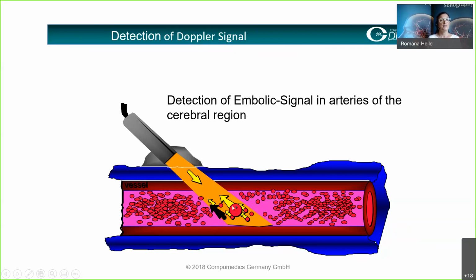And then here we have the example of a blood thrombus, and since this is also heterogeneous tissue, it might give us a little more energy or intensity back than the single blood cells, but due to its size, probably 10 times bigger than the calcified one, it will still be less reflection in comparison to the more stiff material of this, let's say, calcified plaque.